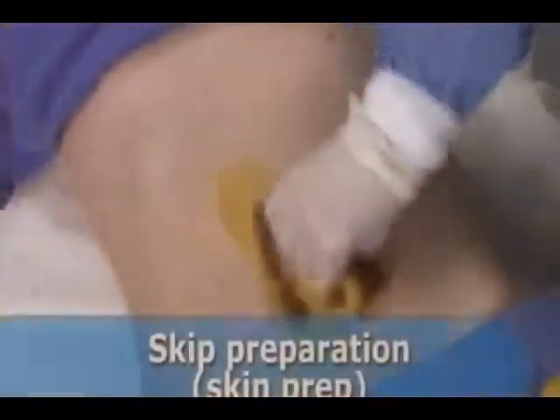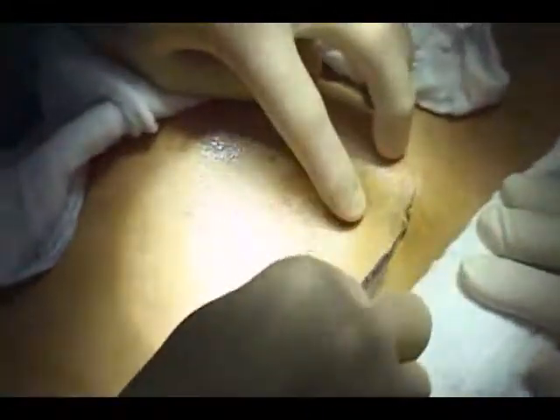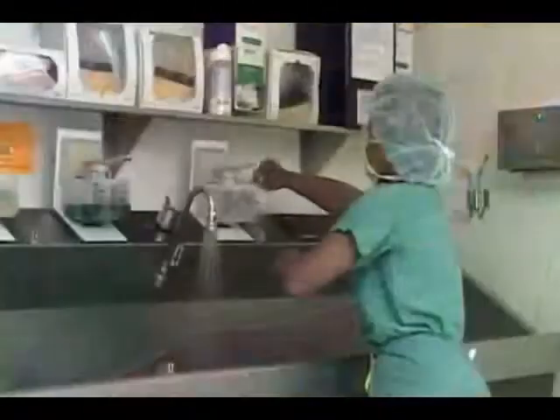The circulating nurse uses sterile sponges and an antimicrobial solution to remove as many microorganisms from the incision site as possible. This procedure is called the skin prep. The skin is the body's major protection against infection. Once an incision is made, the patient is at risk for an infection.